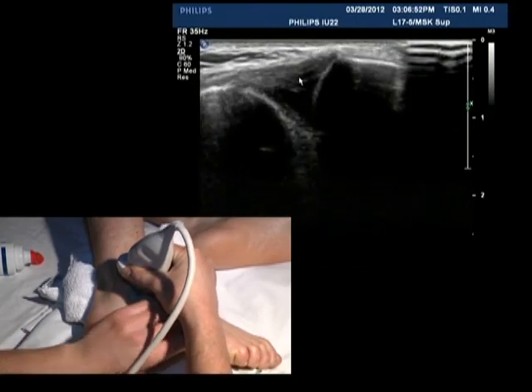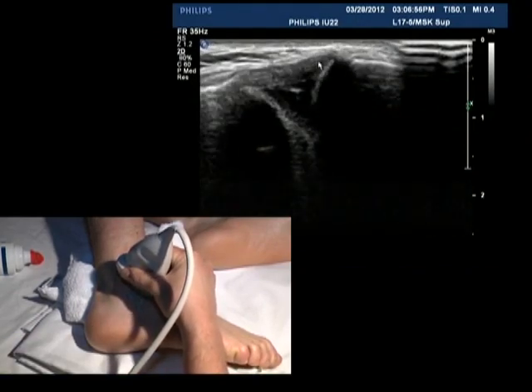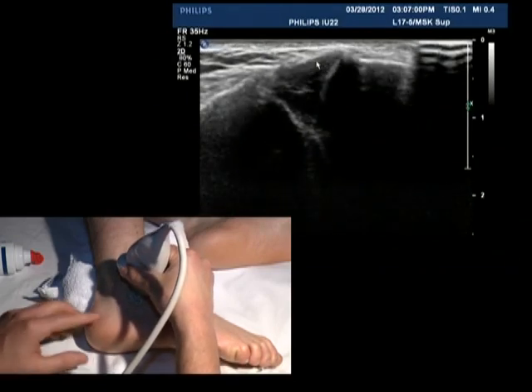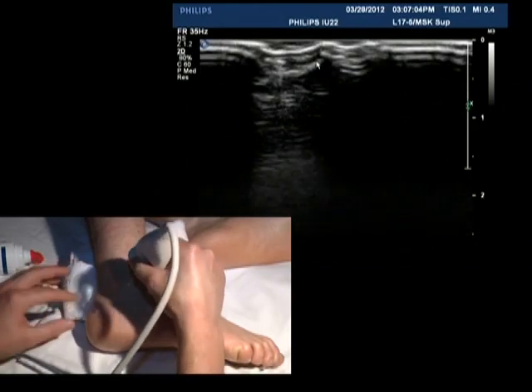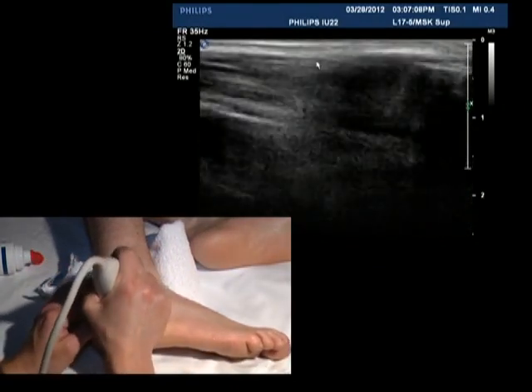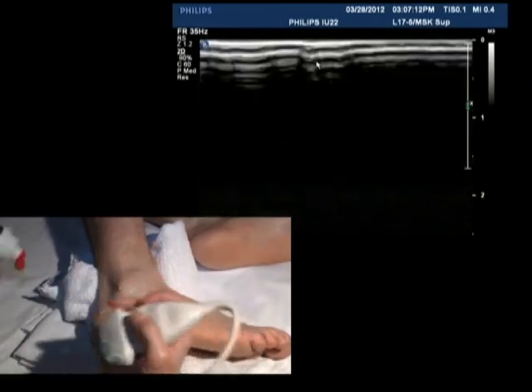And you can actually see that there's a little bit of ossification right here, right at the insertion. Probably had an old injury there as well. So you can see it. Again, I'm not going to do some of the maneuvers because you can do the hands-on session for the purpose of time to look during dynamic ultrasound. I'm happy to do that if you want to come to the hands-on session.